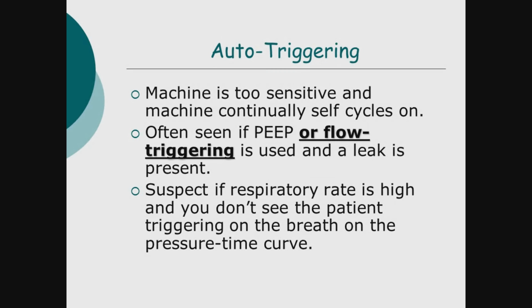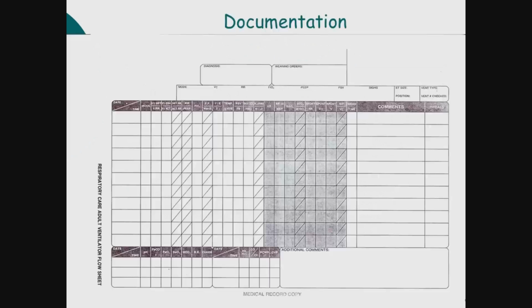And I've had situations, or I've heard of situations, where the patient was brain dead but was triggering the ventilator. It's like, I don't think that's possible. If they're brain dead, they're brain dead. And it was just basically that there was a leak in the system and it was auto-triggering itself. That goes back a long time.